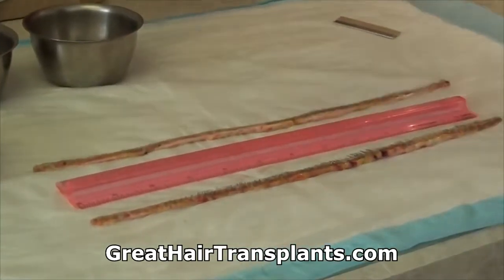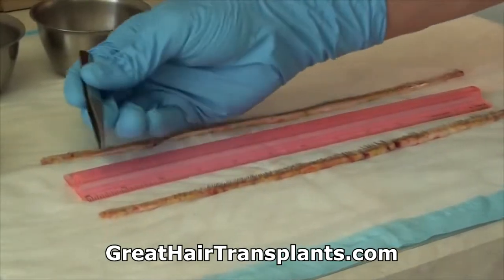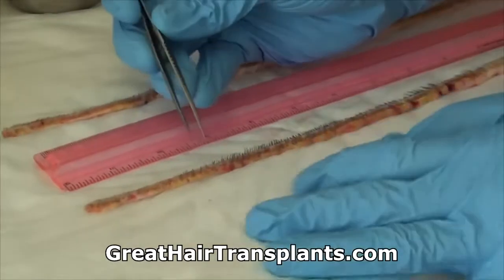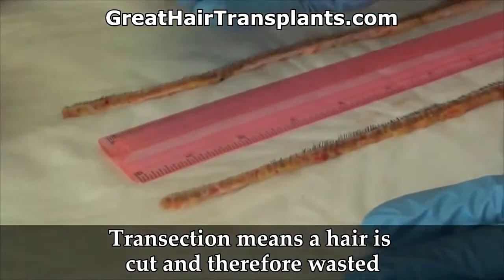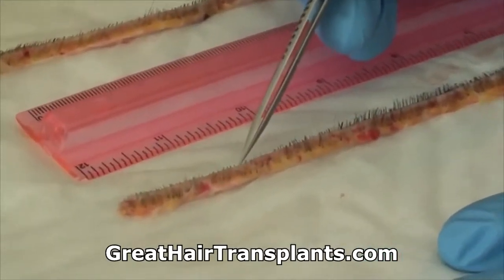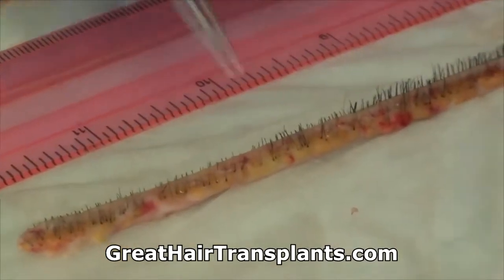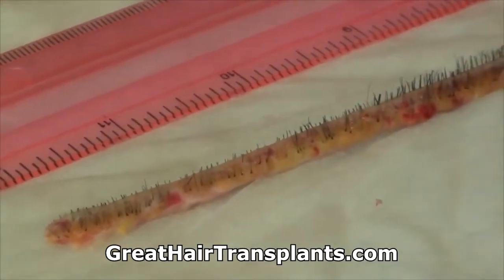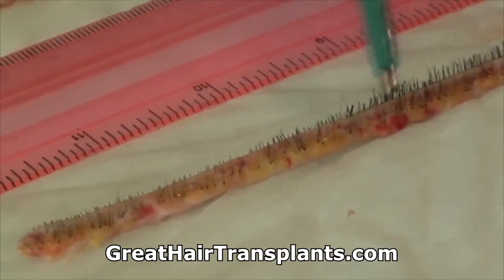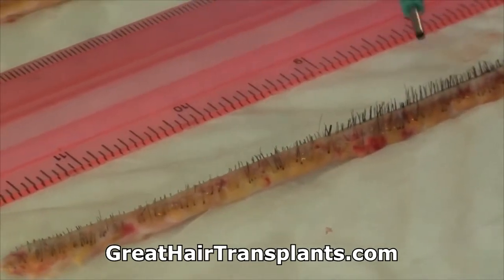Now what happens is, as we're pulling that donor out, we're trying not to transect that follicle. If you look at this strip here, transection is when a hair is cut, which I showed you when we were doing those plugs. So if you look at the bulb of the follicle and then the hair up on top where it comes out, you can see I tried to pull that follicular unit out with this piece here blindly into this area.